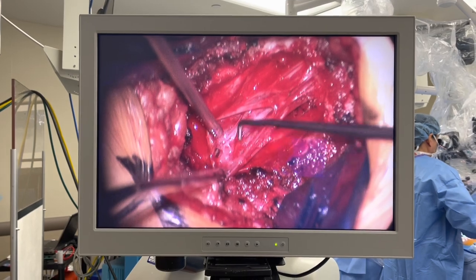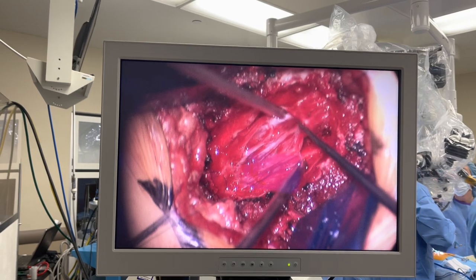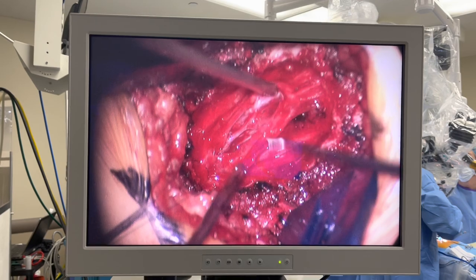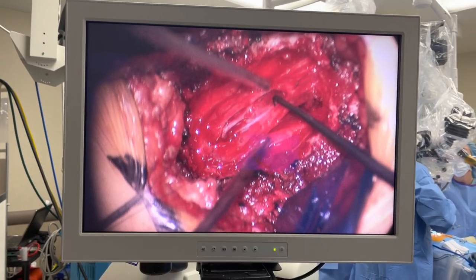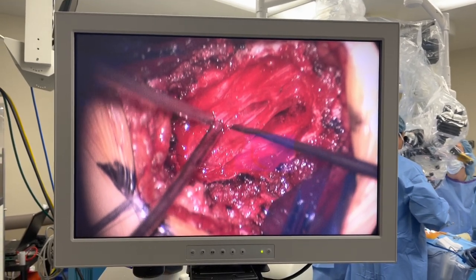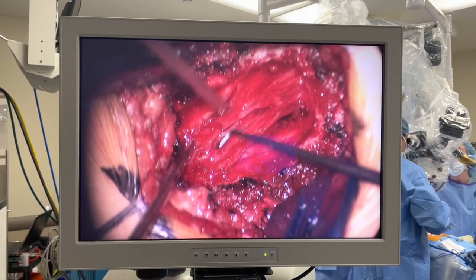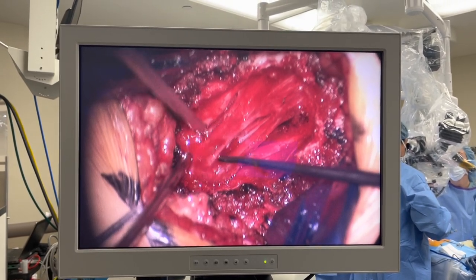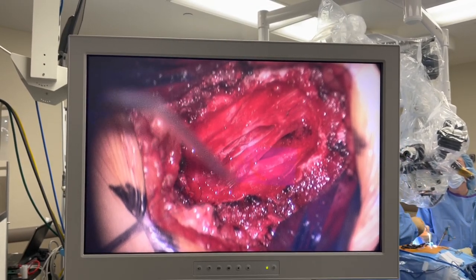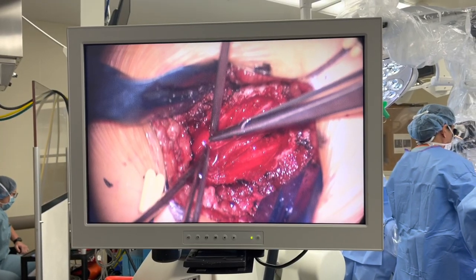Look at this. This is like a little funky cavity. All right, I got distal. Look how thin the membrane is right there. It's crazy. I've got that whole leaflet clear. I've got this leaflet clear. Barely. Yep, I got it. I'm gonna start closing. Okay, let me see. Show me inside there.